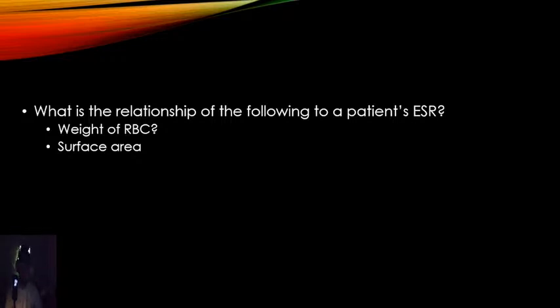So it's indirectly proportional. All right? So clear? Kung sino yung mas mabigat, siya yung mas magpapataas ng result. Kung sino yung mas magaan, tapos mas malaki, mas baliktad ang resulta. Alright? So, tinagalog ko lang.